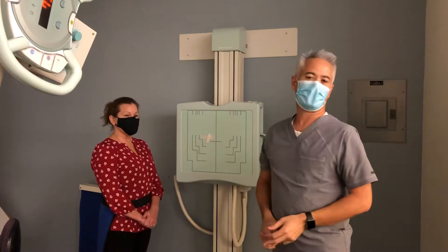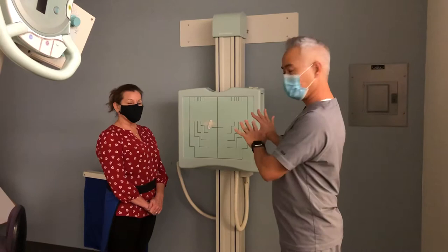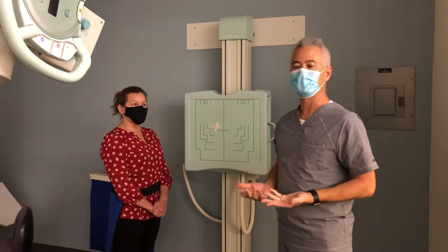We're going to come to the obliques now and show you how to do the PA obliques. There are also AP obliques that you'll see some techs do. In this program, we teach PA obliques because we want to reduce the dose to the breast and the thyroid. When you do them facing the board as opposed to facing the tube, you can reduce the dose by up to 90% — so 90% less radiation to those two areas if you do them correctly.